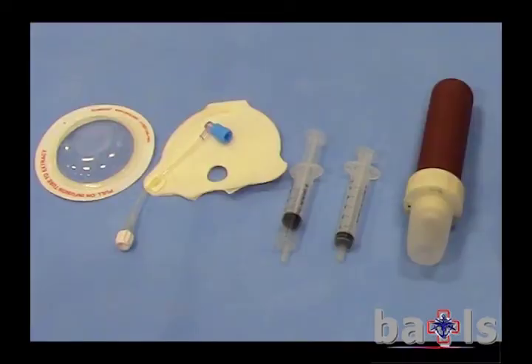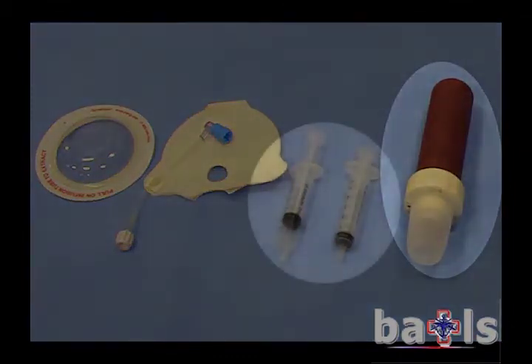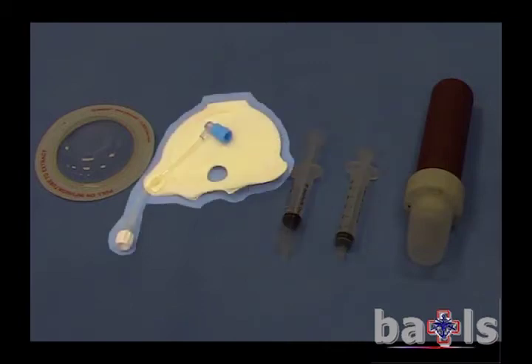The equipment required is as follows: a FAST IO device, two 5ml syringes, and a target patch.